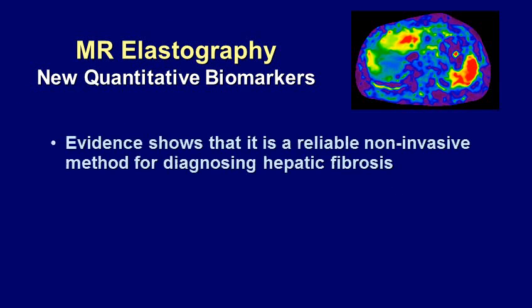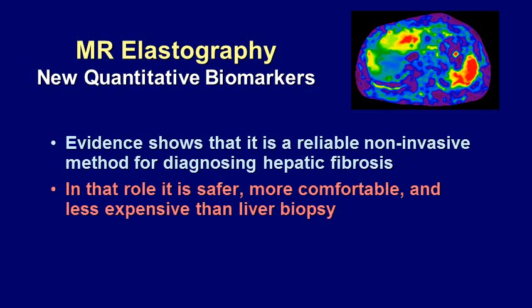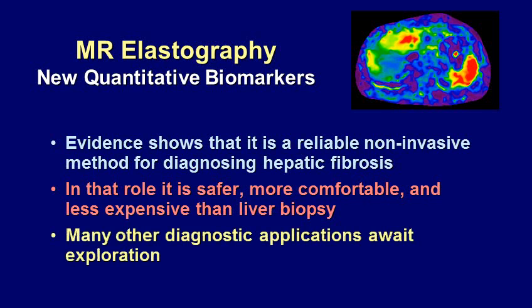So in conclusion, there's now good published evidence that MR elastography is a reliable non-invasive method for diagnosing liver fibrosis. And in that role, it's safer, more comfortable, and less expensive than liver biopsy. And there are still many other applications to explore.